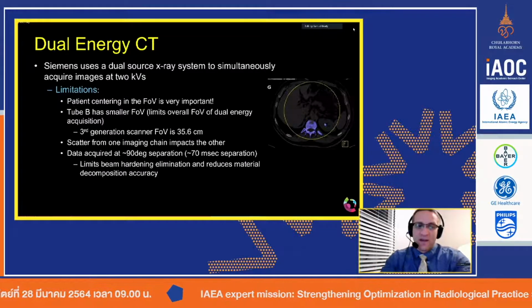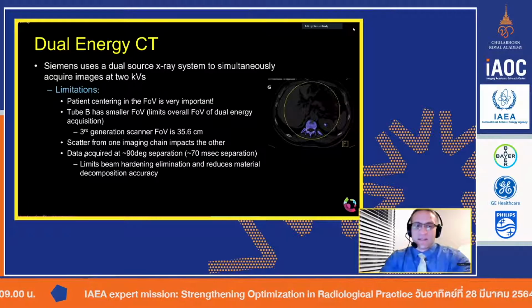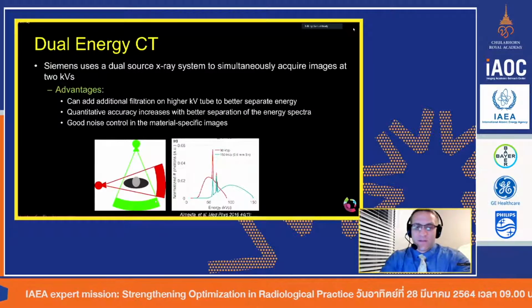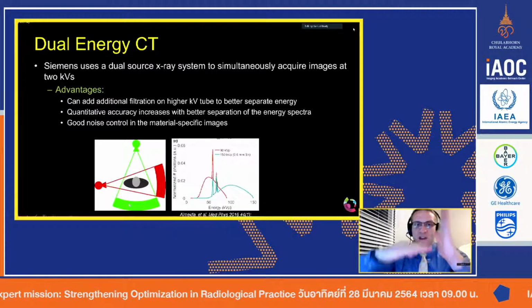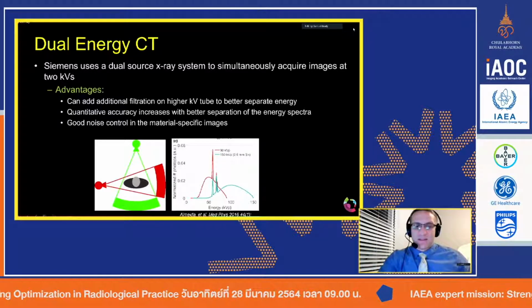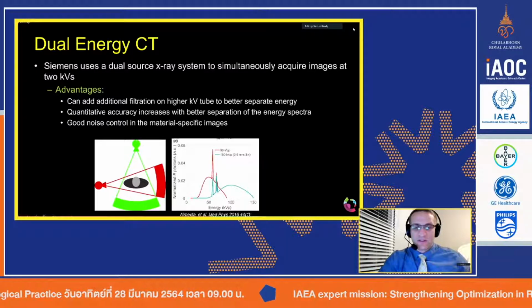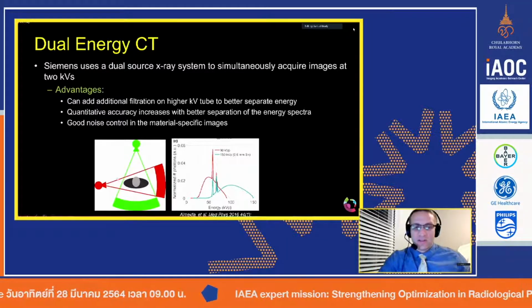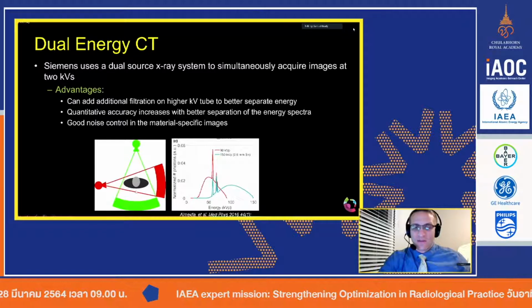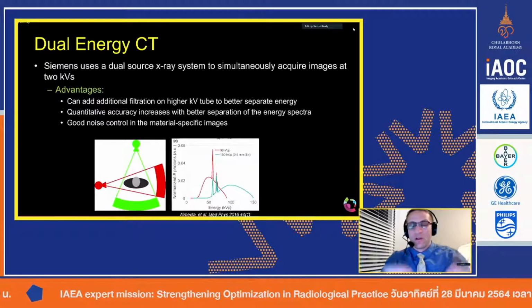And then finally, the fact of the matter is that the scanner itself, the X-ray tubes themselves are 90 degrees apart. In other words, as you image through this part of the body with this kV, and then you spin around and you image the other part of the body with a different kV, so one at, let's say, 80 and another at 140, well, that's fine.